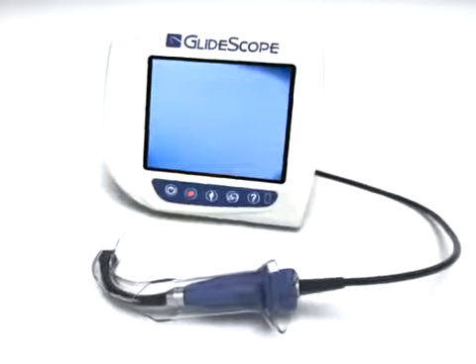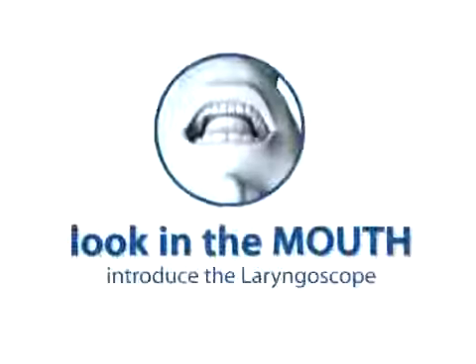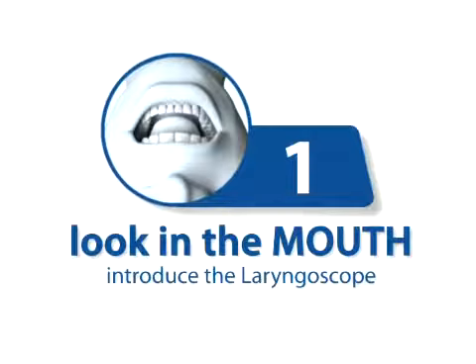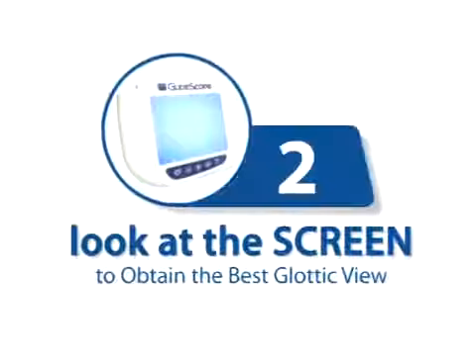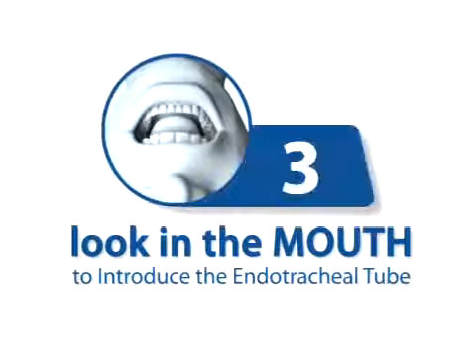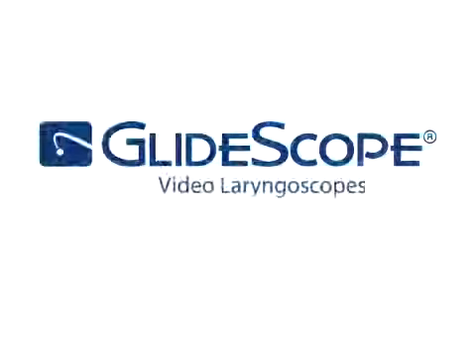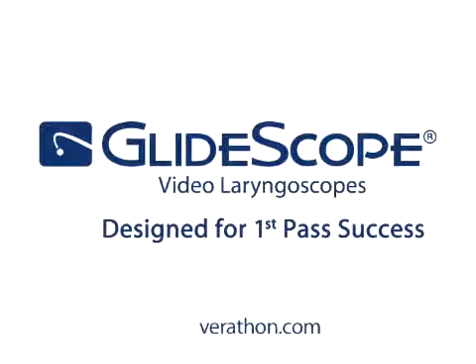To review, the 4 steps to successful GlideScope video laryngoscopy are: in the mouth, to introduce the laryngoscope; at the screen, to obtain the best glottic view; in the mouth, to introduce the endotracheal tube; and at the screen, to intubate. GlideScope video laryngoscopes, designed for first-pass success.